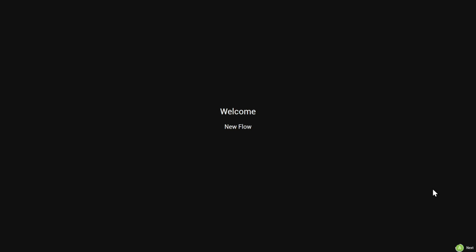So I stayed on it. It now says eyes open. Please keep your eyes open. It sees this was not skipped, now timed. This was timed, and it says 3 minutes in the bottom right. We might change it so that it's a little more prominent. Now, we have a webinar. We cannot wait 3 minutes, guys. We have time pressure here.